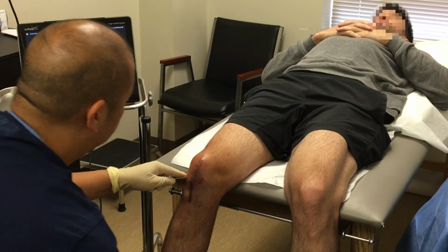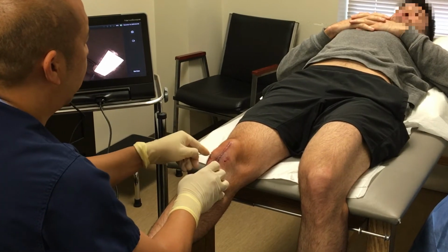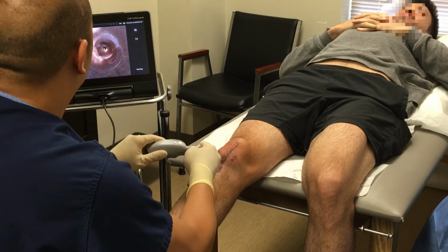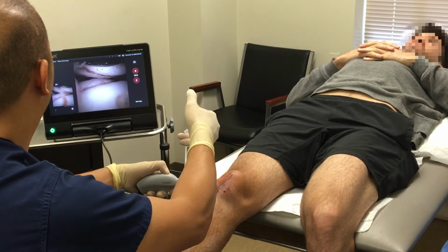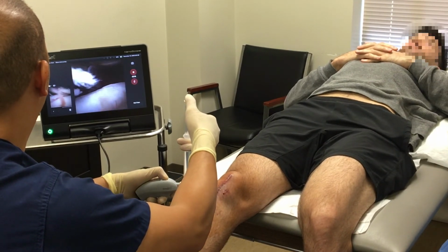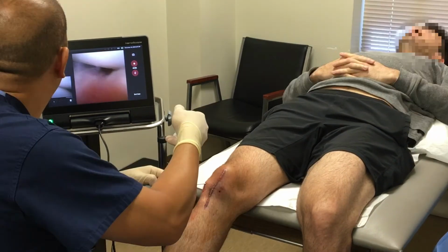I'm in the notch, now I'm withdrawing, and I'm going to advance it into the suprapatellar pouch with a knee extension. I'm entering the NanoScope again, and then I'm going to insufflate with fluid, and you can see this edge of the trochlea. You could see where the edge of the OATs plug has been placed. It looks like it's incorporated nicely.